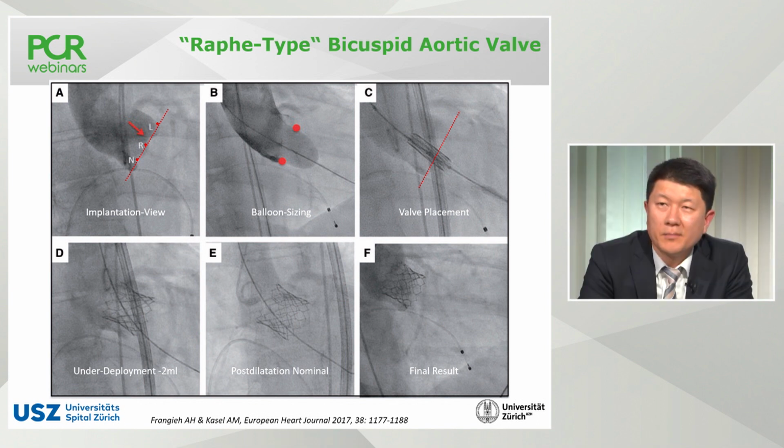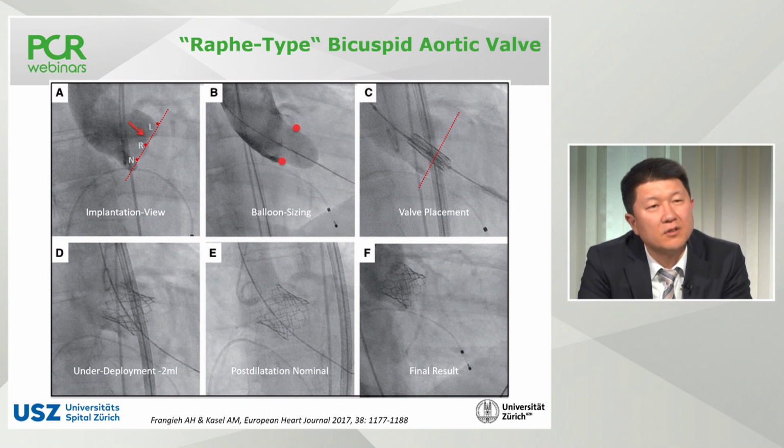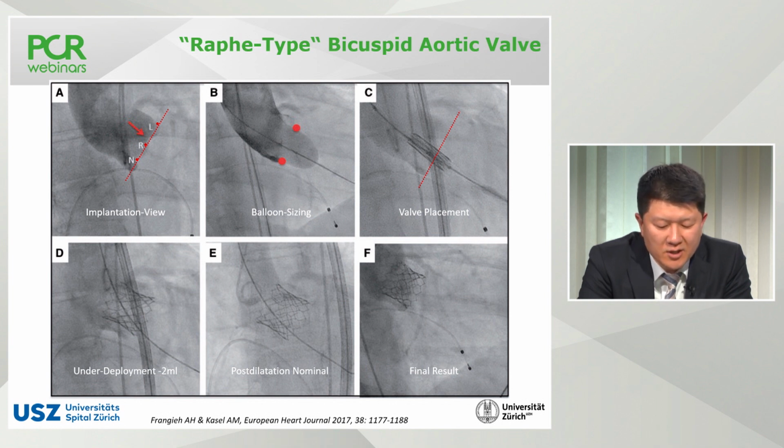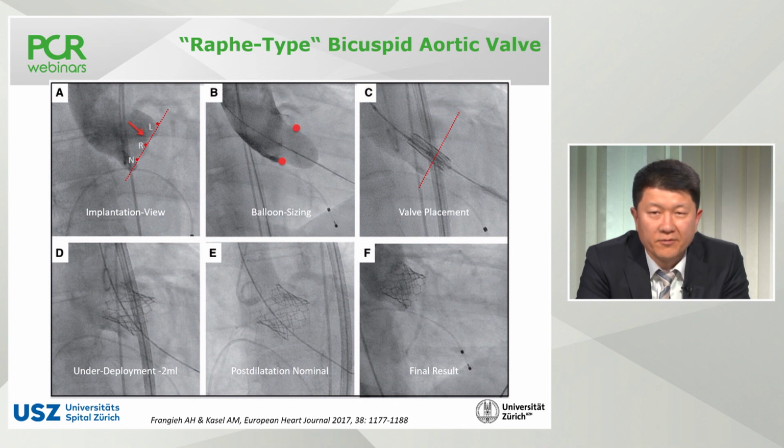Yeah, maybe Marcus showed us two very nice and very illustrative examples on using balloon expandable devices. And I think that actually in most anatomies, you can also use self-expanding technologies. And if you use self-expanding technologies, it is really important, as you already mentioned, to have an effective predilatation. In most anatomies, it really depends on the amount of calcification that you have.